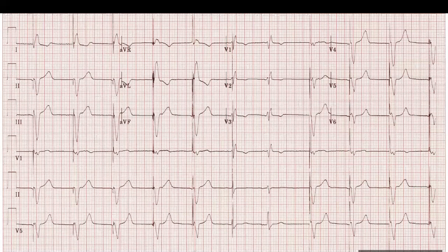So the pacemaker did deliver an impulse, but there was already an intrinsic heartbeat, right? They both happen at the same time. So the QRS is not a result of the pacing. It's not fusion between the pacing morphology and the intrinsic QRS. It's pseudo fusion, just happening exactly at the same time. The pacing didn't work and the intrinsic morphology took over. So here is the intrinsic, and when you follow, there is a pacer spike and QRS, and it continues on.